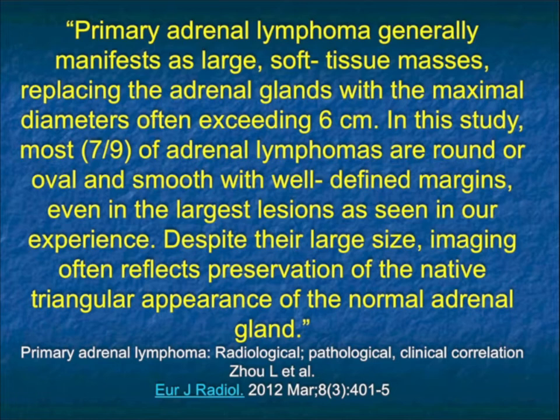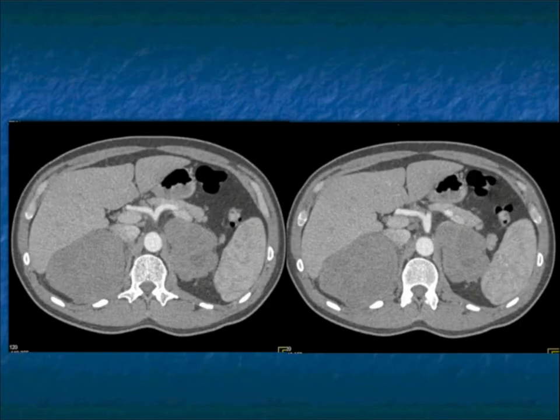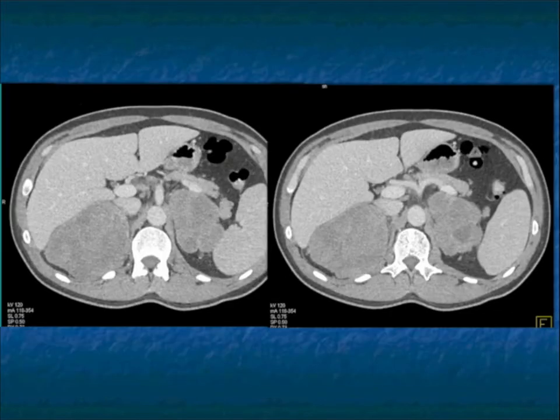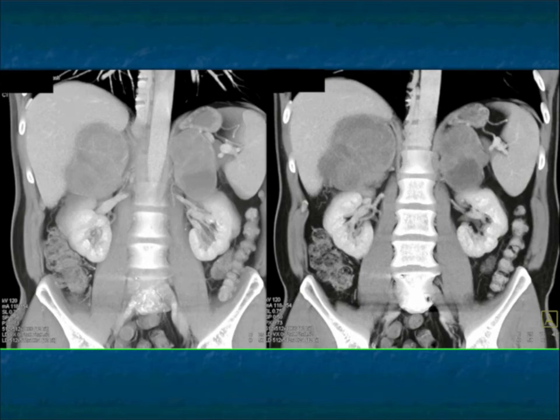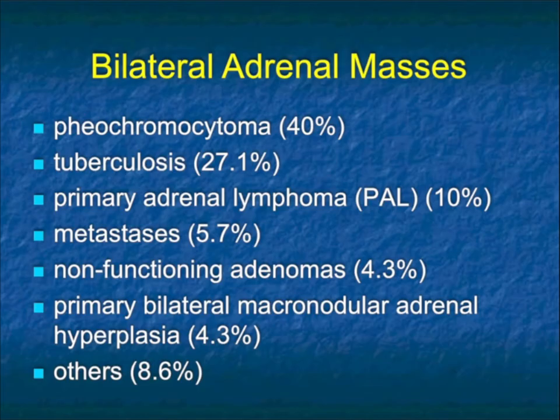Some things to remember: despite their large size, imaging often reflects preservation of the native triangular appearance of the normal adrenal gland. Where primary ACCs tend to be round or oval, lymphomas tend to be more triangular — that can help you every once in a while. Most of you have never seen primary adrenal lymphoma, so I wanted to show it. It's in the differential of bilateral adrenal masses, and notably primary adrenal cortical carcinoma is listed only under the 'other' category in some differentials.